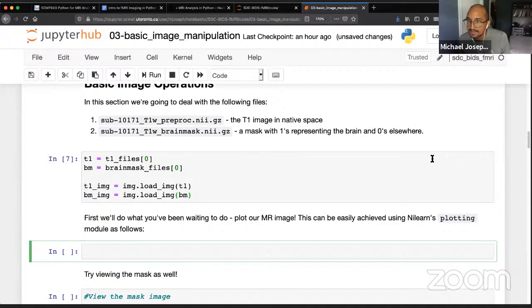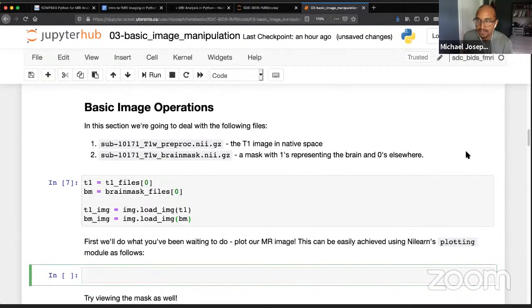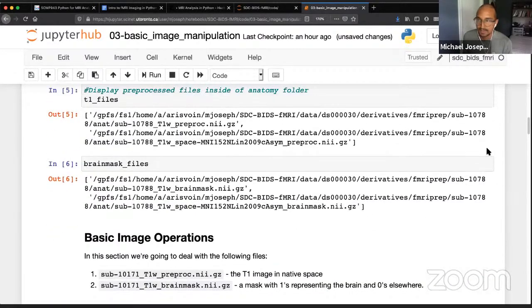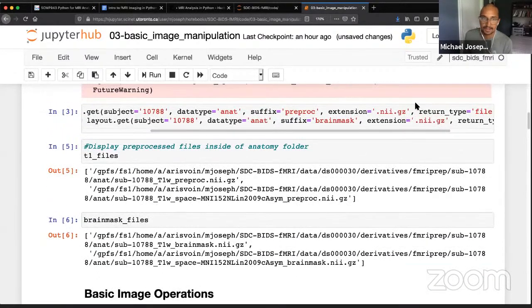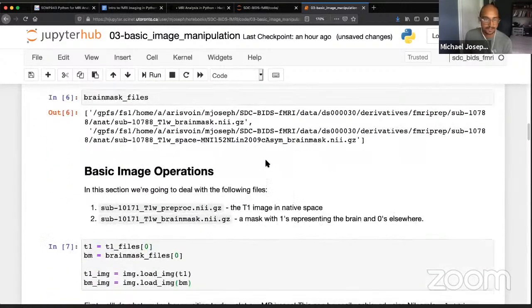Okay, Jane. Cool. Yeah, that's great. The solutions are there for you. If you run into any issues or questions while running the solutions, feel free to post in the chat, and then I'll just go back to help clarify some things.